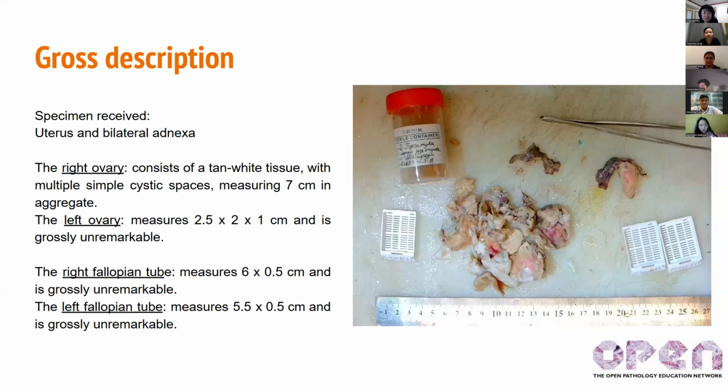Thank you. It was obvious that the larger hilar vessels were what were involved, at least in some of those areas. And if you just have a native ovary without the cystic or fragmented changes from, maybe, laparoscopic extraction, you might actually not sample those arteries as thoroughly as you would need to detect this. So I think there's certainly a potential to miss this diagnosis if your sampling doesn't include the hilus of the ovary.